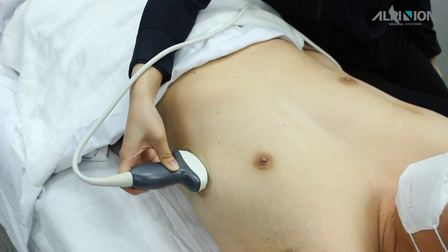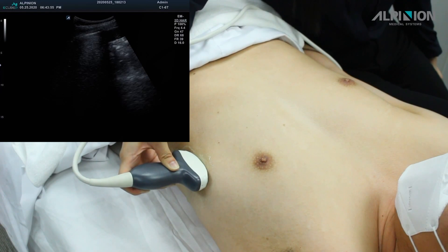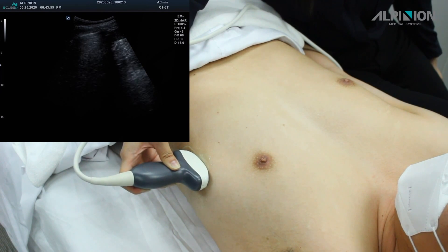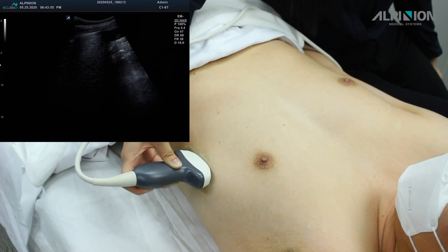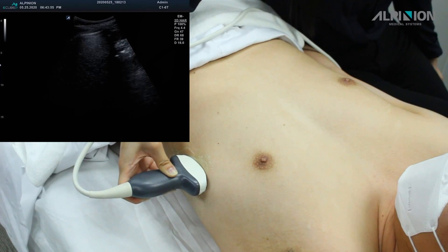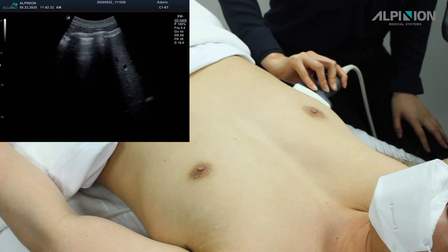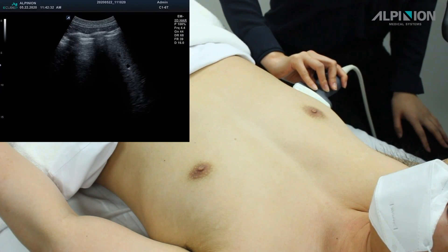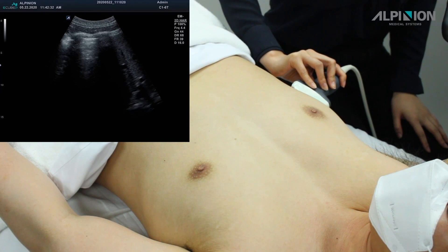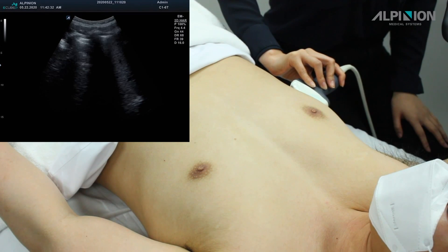For the last part, we are going to scan section 4. In section 4, what you need to see is the end of the lung, which encounters the spleen. You can scan the right lung the same way as you did with the left lung. However, as you scan the bottom of the lung in section 4, you need to identify the spleen on the left and the liver on the right.